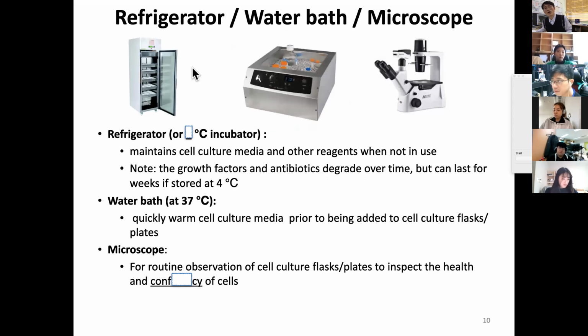And you will find in a wet lab refrigerators, a water bath, and microscopes. So refrigerator, as you all have in your home, okay, what's the temperature of a refrigerator? Yes, 4 degrees Celsius. The incubator is usually the same as our refrigerator.